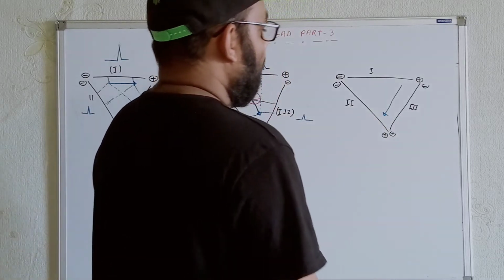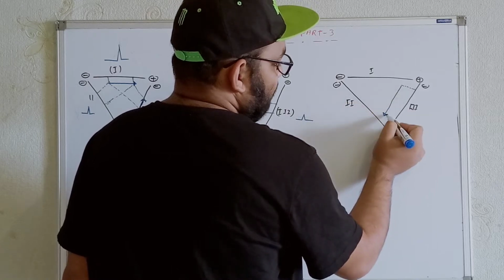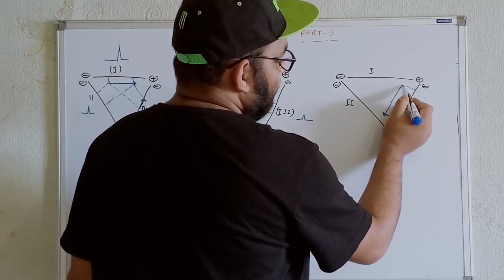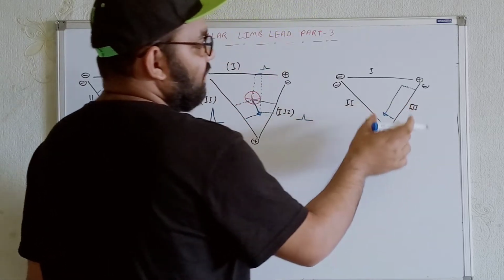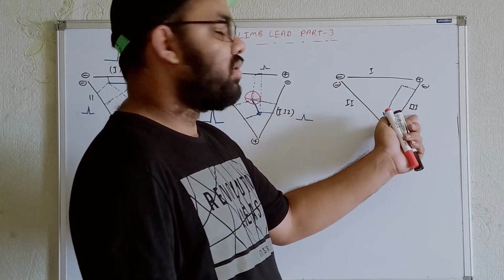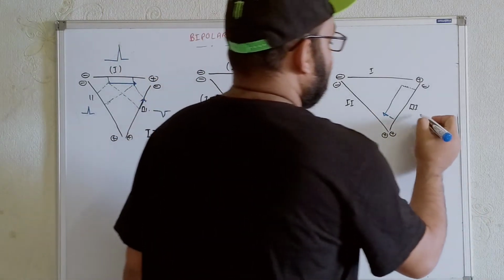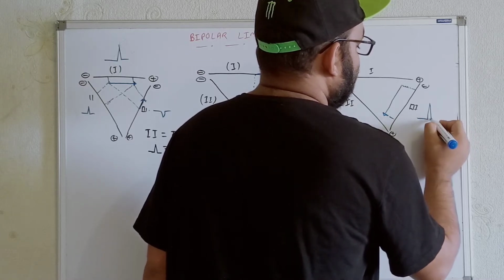Okay. Now try to understand for lead number 3, whatever we see, the major portion for lead number 3 will get over here. If we draw the perpendicular, we will get the parallel to what? Lead number 3. So the major ventricular depolarization we are getting is parallel to lead number 3. So definitely the depolarization will be stronger over here.